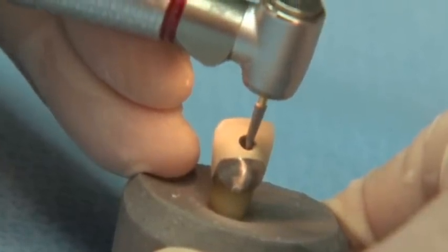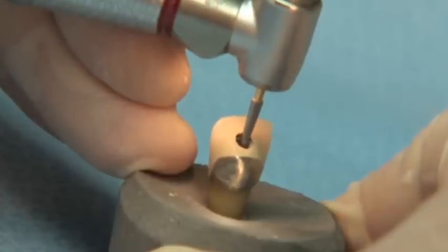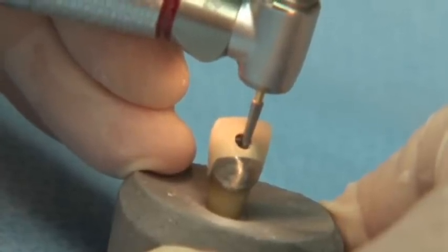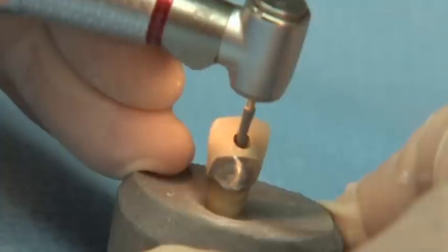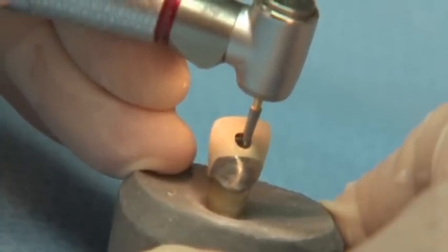The Safe End tip will prohibit the access from getting deeper, but will allow for lateral expansion. EndoSafe end has no step at the tip. This burr will prevent ledging of the axial walls and the RoundSafe end prevents perforation of the furcation areas.